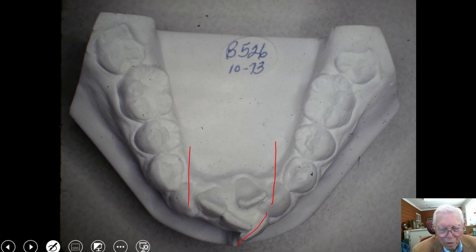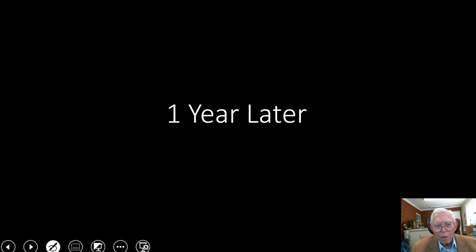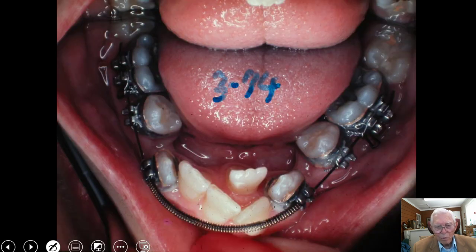Here are the four lower anteriors — the laterals and centrals. We're going to expand those teeth and line them up. I extracted the first bicuspids on the lower arch, which gave us some room for the cuspids to slide over. We then took the cuspids and moved them back with the root leading the crown — so the roots were more distal than the crowns on most of these teeth.